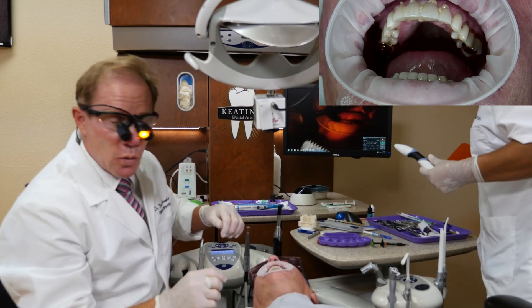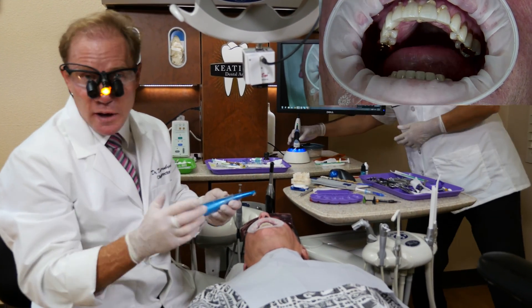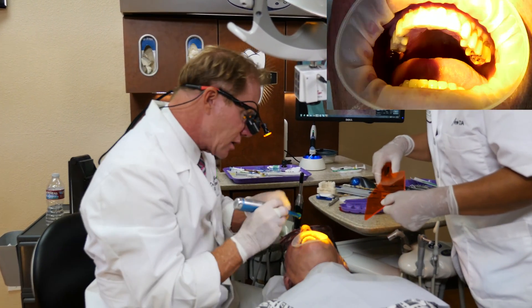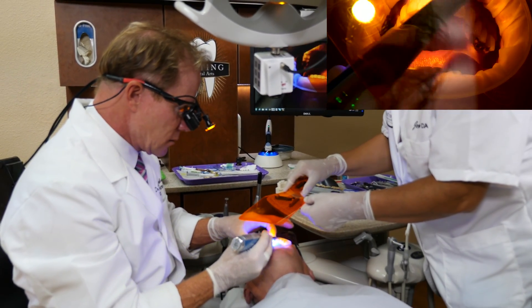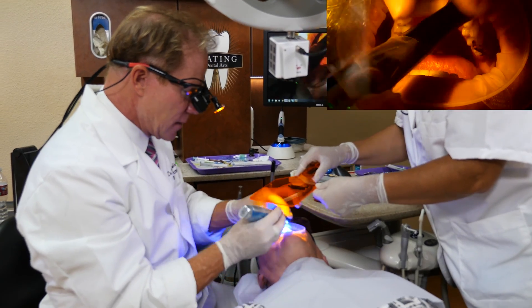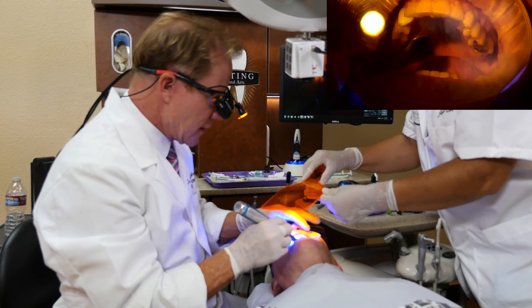We're going to be using the tack and wave technique — that was our tack. Now we have our regular light guide. If you only had one light, you would just switch and take the 2mm tip off and put the regular tip on. Now I'm going to cure back and forth for about five seconds per tooth — that's the wave.